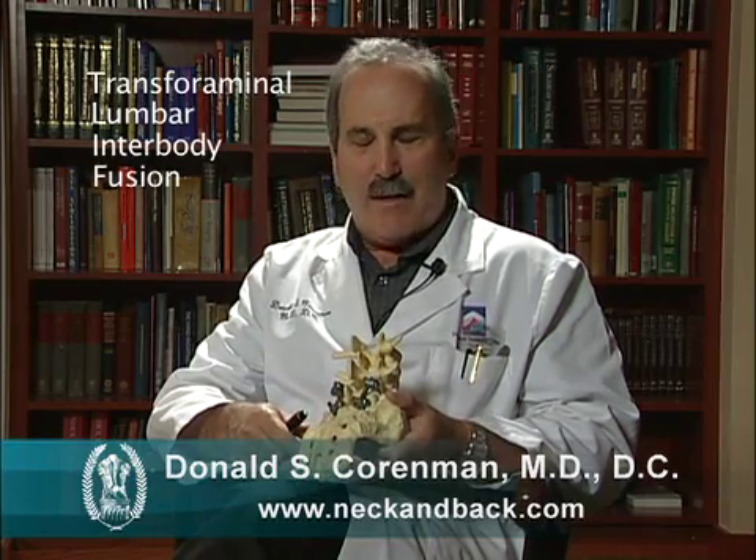We're going to talk about a surgical procedure called a TLIF, which stands for Transforaminal Lumbar Interbody Fusion. To interpret that from medical terminology, we simply remove a portion of the facet, go into the disc and remove whatever degenerative changes there are, and we create a fusion in the disc and along the back of the vertebra.